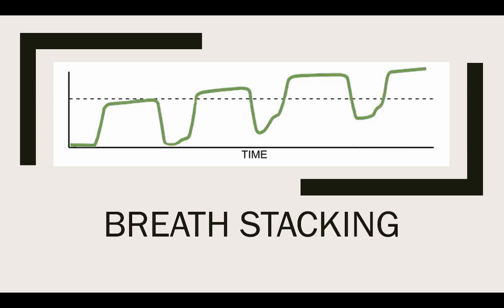capnography waveform. If you ever see this waveform on your capnography, it means you're breath stacking. It means you're breathing too quickly for your patient. Normally, patients don't do this on their own. This is us via BVM. This is us via ventilator. We're just breathing too quickly for them.